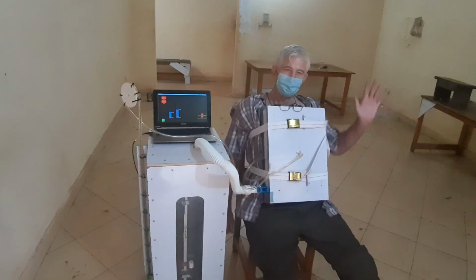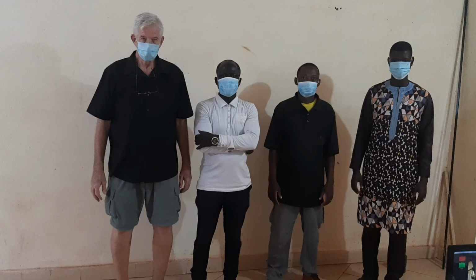My name is Hank DeBay. I'm an engineer and I have lived in Africa for 12 years working on various technical projects, but this is the most important one. This is me, the guinea pig, enjoying the Kabako ventilator. Currently our team is only myself and 3 others. There's a great deal we need to do.